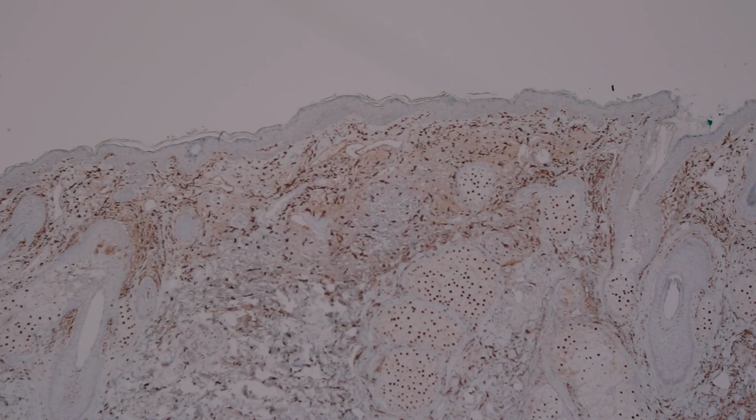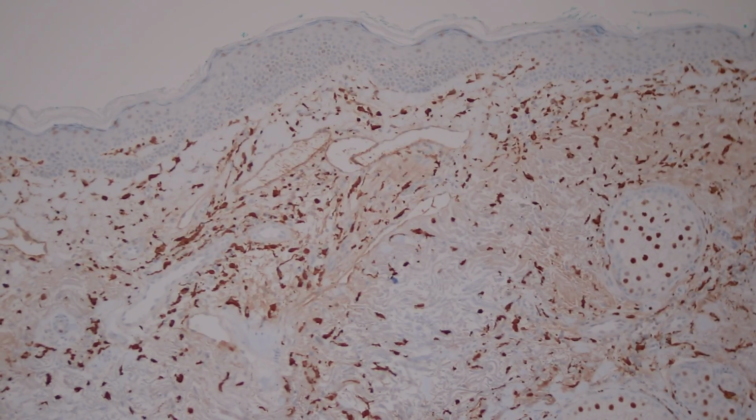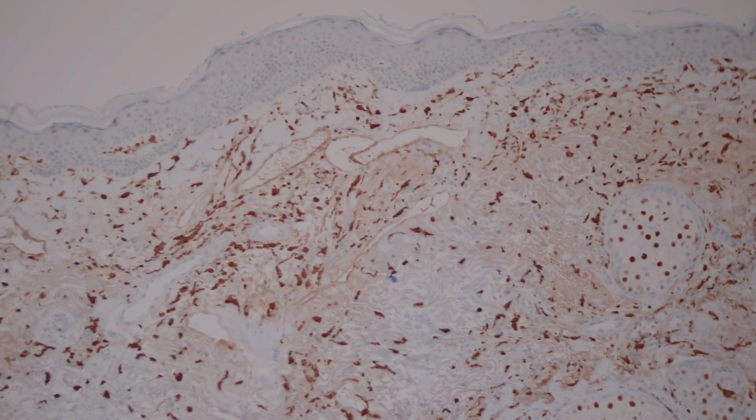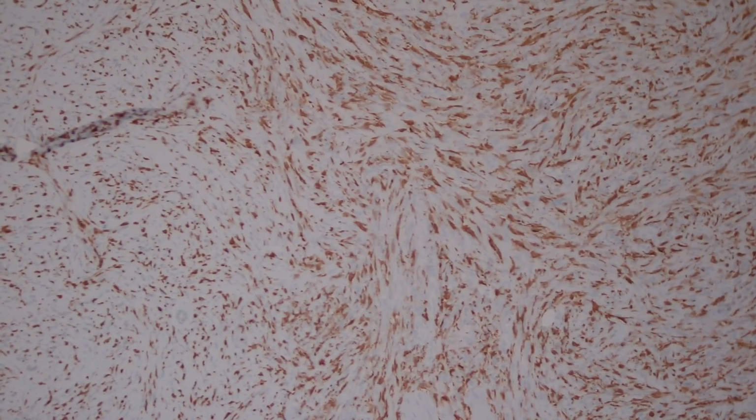And lastly, we'll talk about Factor XIIIa, which is a stain that I do not really use much at all for spindle cell tumors, because it also has lots of dendritic cells that are scattered throughout the dermis and stain. And these cells tend to be increased in number in dermatofibromas. So some people like to use it, but it stains lots of other things. Like, for example, this is a spindle cell carcinoma, and there's tons and tons of Factor XIIIa positive cells scattered in this thing, but it's not a dermatofibroma.